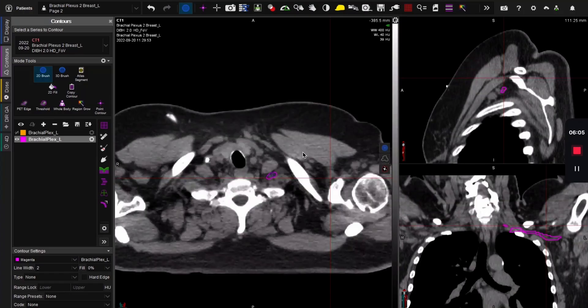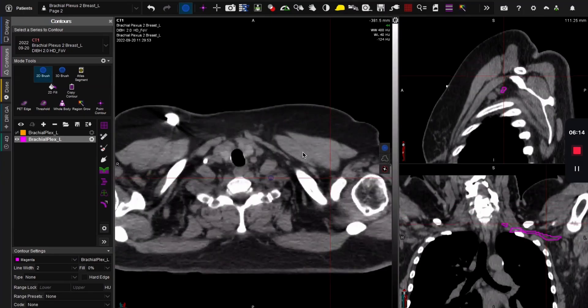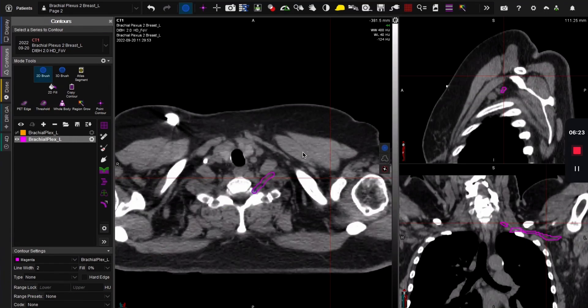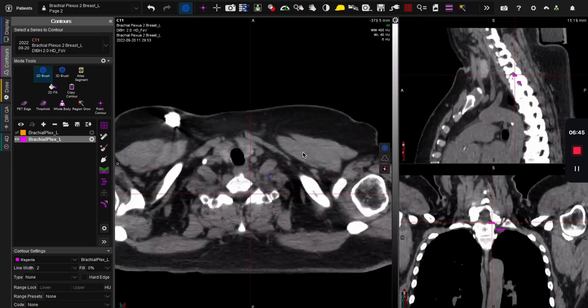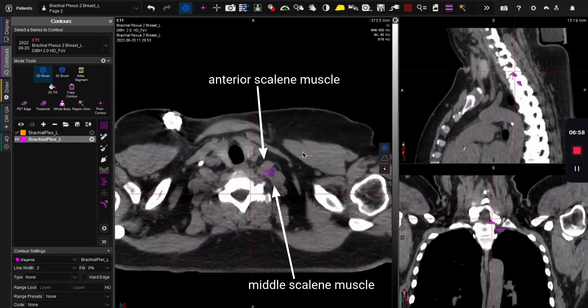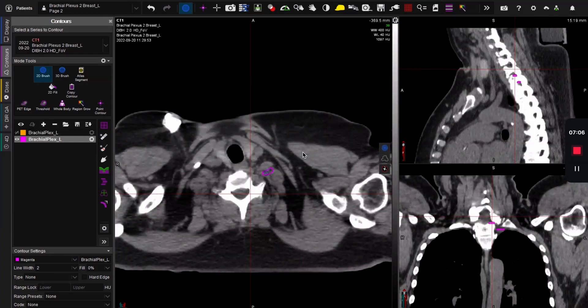I'm just doing one slice at a time — no fancy tricks, no interpolation, just one slice at a time. Slow and steady. Then this is where you bust out your move: you see the next neural foramen opening and you dive in. I've clicked here so I can check the sagittal, and sure enough I'm in the next vertebral body space. I have to keep going up and continue having this structure here, keeping it between the anterior and middle scalene. You really have to concentrate on where you were on the previous slice, because it's very easy to lose track.